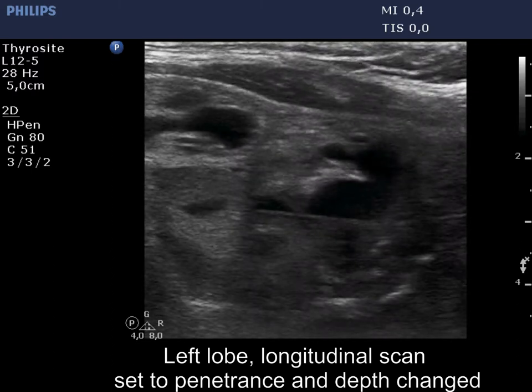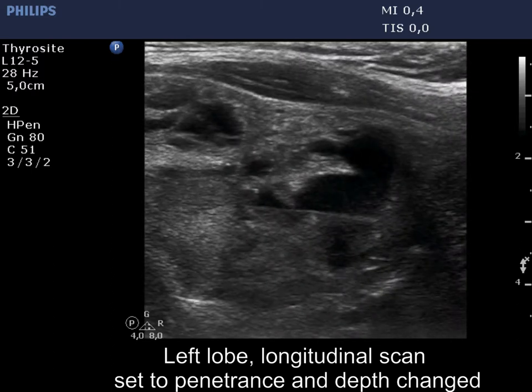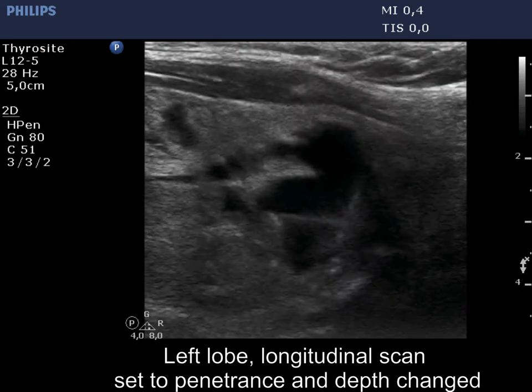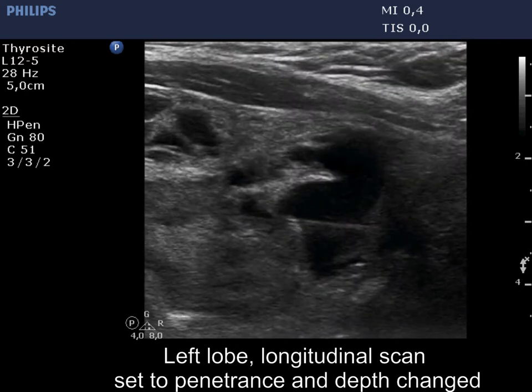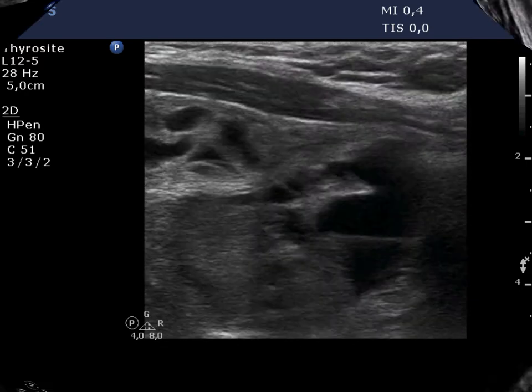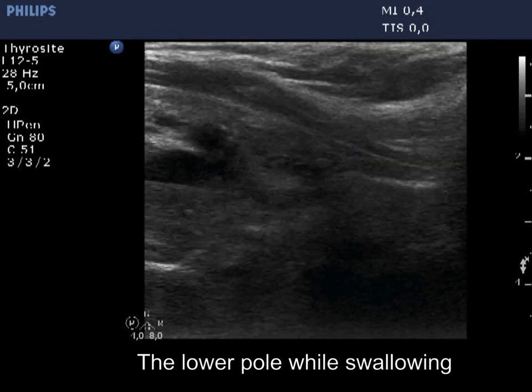The lower pole of the nodule is not visible but came into sight while swallowing. The first image was recorded before swallowing, while the next was recorded during swallowing.